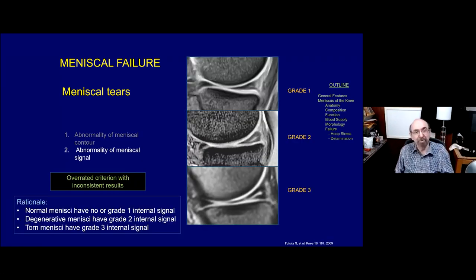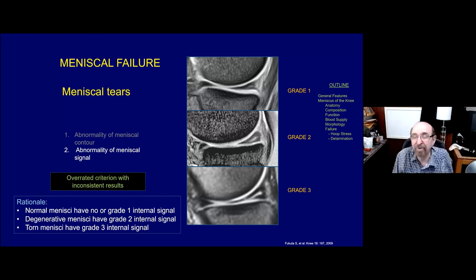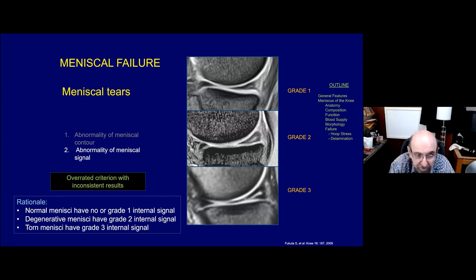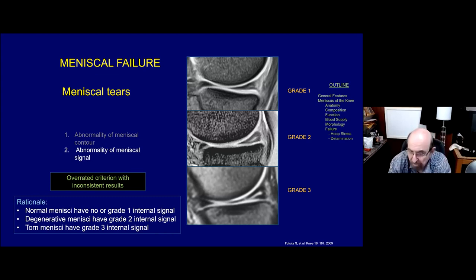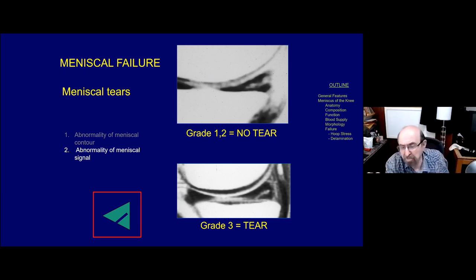The second criterion, an abnormality of meniscal signal, is simply overrated - the results are inconsistent. The grading system introduced in the 1980s and 1990s classified signal within the meniscus: Grade 1 had a little signal, Grade 2 had more extensive but didn't violate the surface, and Grade 3 violated one of the surfaces - that was considered a tear. Normal menisci have no signal, or Grade 1. When you got to Grade 3 you were dealing with a tear. But the problem is the difference between Grade 2 and Grade 3 may be just a couple of pixels.